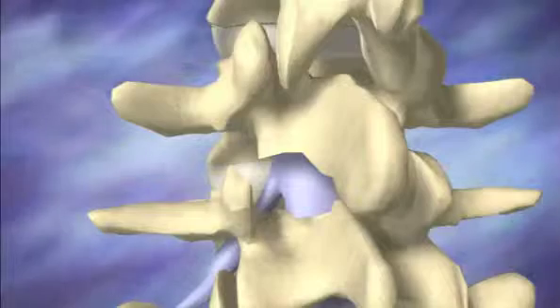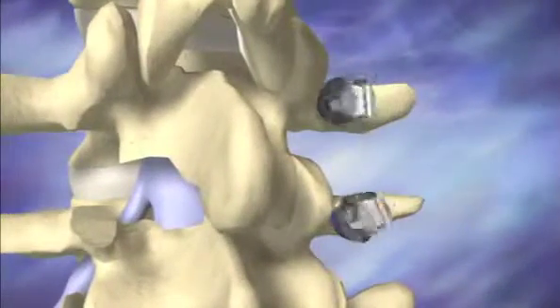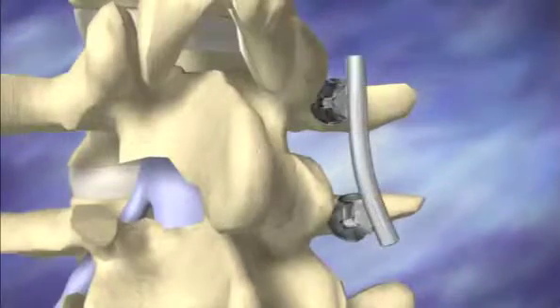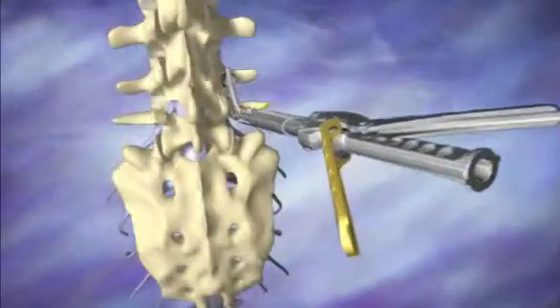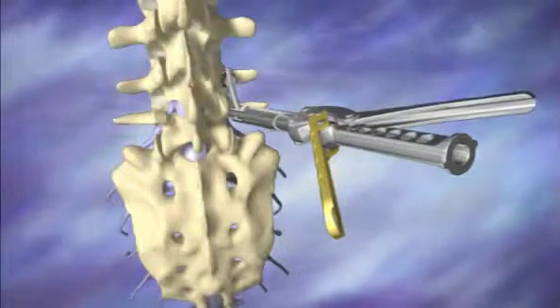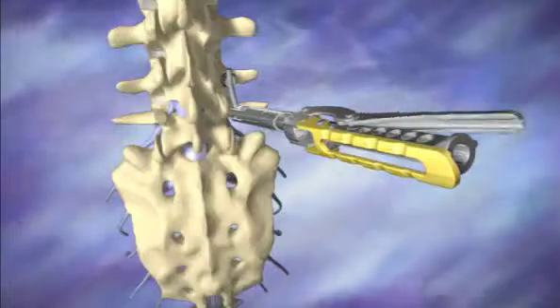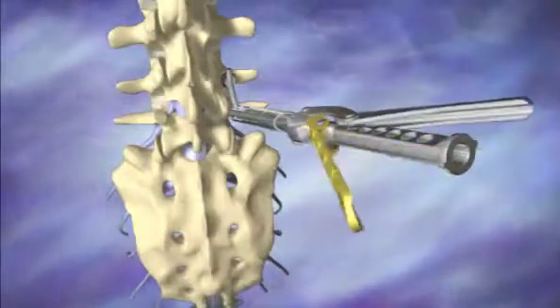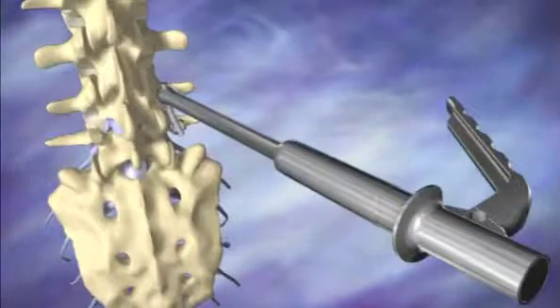anatomy. After the pedicle pathway has been prepared, appropriately sized screws are inserted into the pedicle, followed by the introduction of the rod using the rod pusher. Rod reduction may be achieved using the dragonfly. The dragonfly, as well as the quick locker, may be used to partially lock the screw head on the rod on the contralateral side.